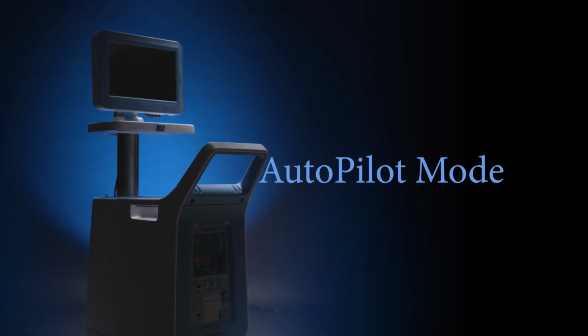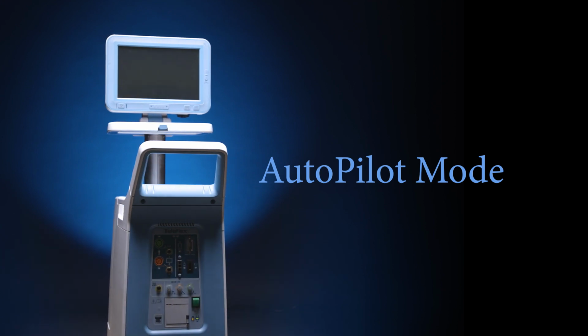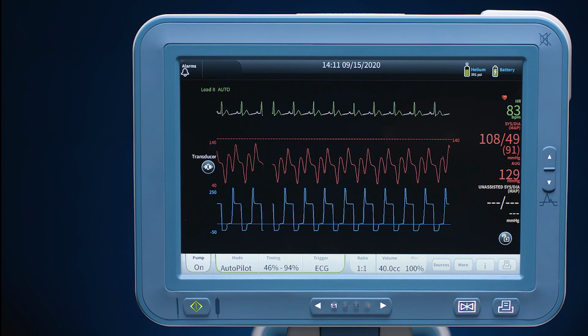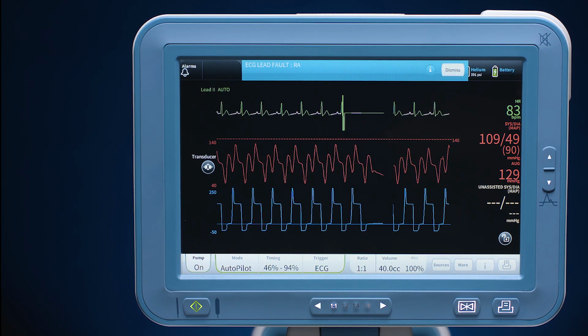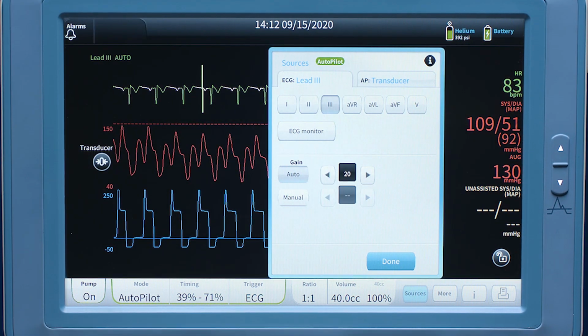In autopilot mode, the user can change ECG leads, sources, and gain control. However, autopilot mode will automatically change the ECG leads and source to maintain optimal IAB therapy as needed. The default lead is lead 2 when skin input is chosen. To change the ECG lead or source, touch the ECG waveform.